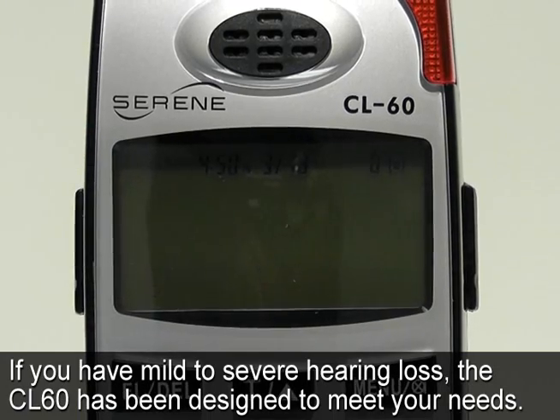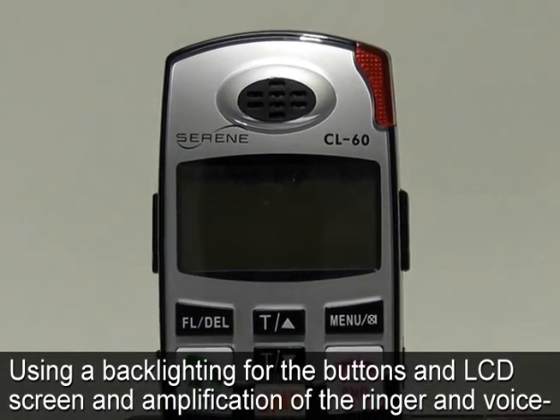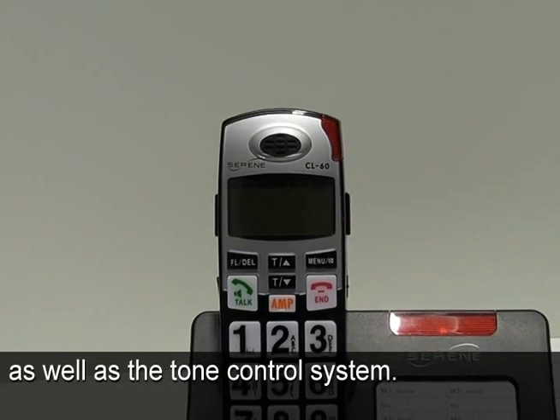If you have mild to severe hearing loss, the CL60 has been designed to meet your needs, using backlighting for the buttons and LCD screen, amplification of the ringers and voice, as well as the tone control system.